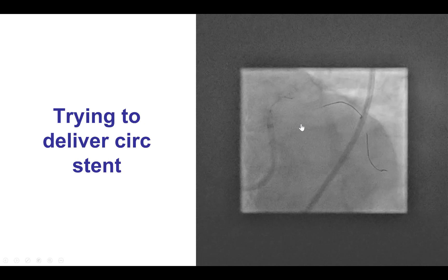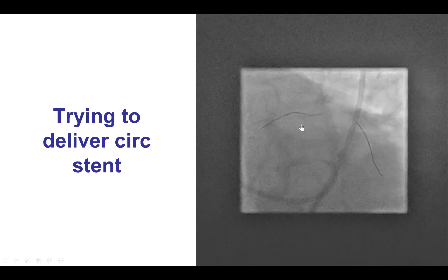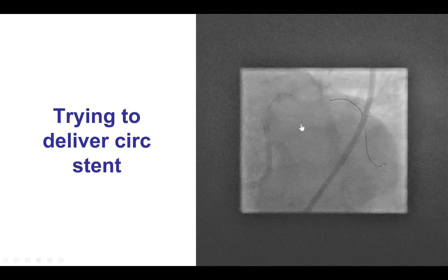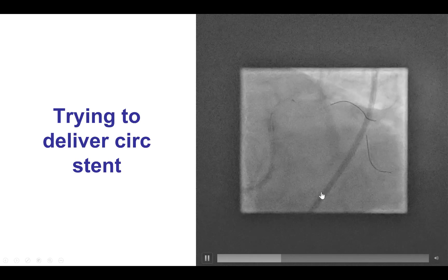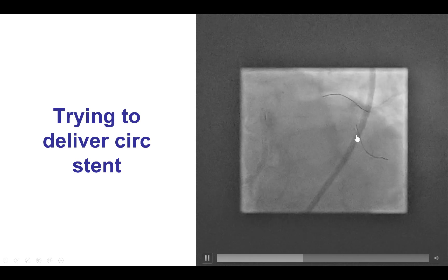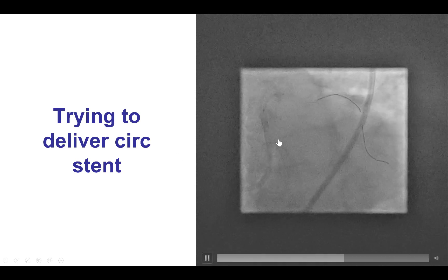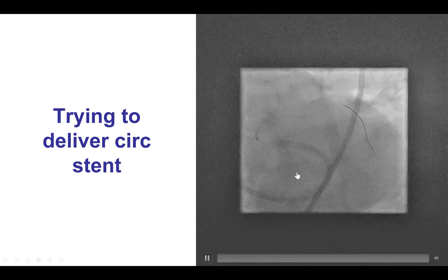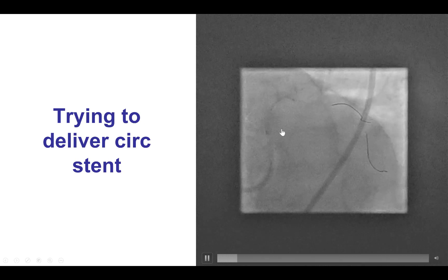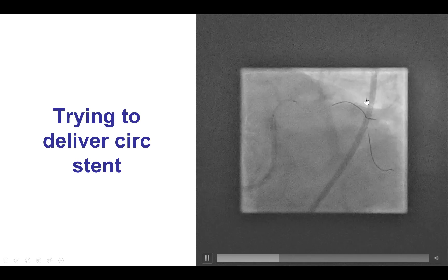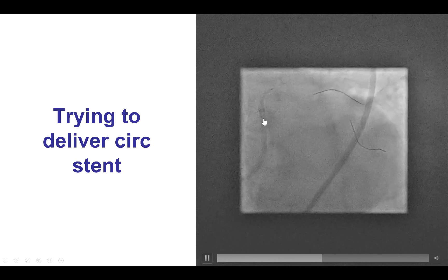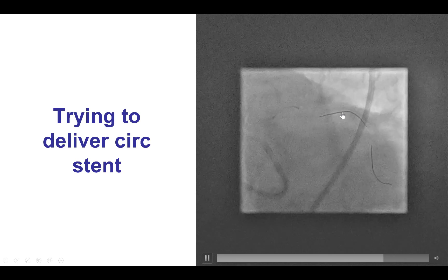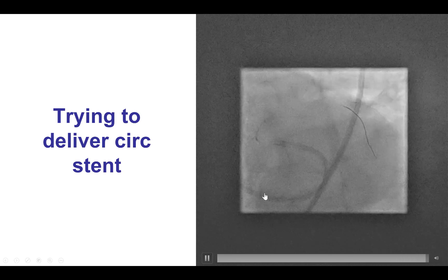So now our plan is to advance a stent into the circumflex. And this is what can happen sometimes — even though we did have an 8-French femoral guide, which is very supportive (that's an EBU-3.75 guide) — if one pushes too much, even with having two wires into the vessel, then one can lose everything: the guide position, which then pulls the wires back.